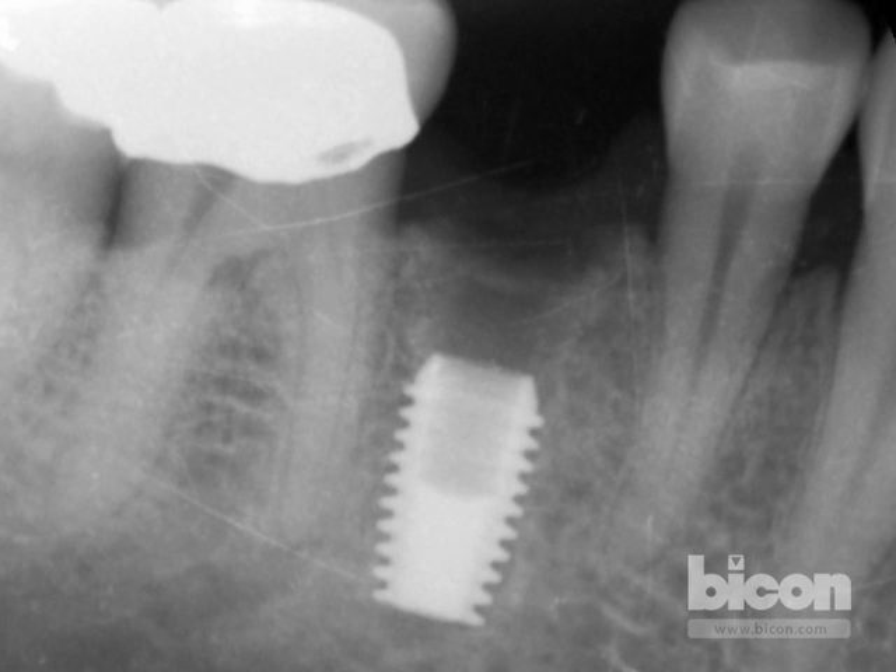This is the post-operative radiograph. The implant is exactly where we wanted it — roughly two millimeters, actually a little less than two millimeters, considering where the buccal plate was missing. Mesially and distally it's within tolerance of about three and a half to four millimeters. Had we placed a six millimeter implant to obliterate the entirety of the socket, it would have been a little too deep and outside the realm of periodontal health. In this case, this implant will be eminently restorable without any issues.